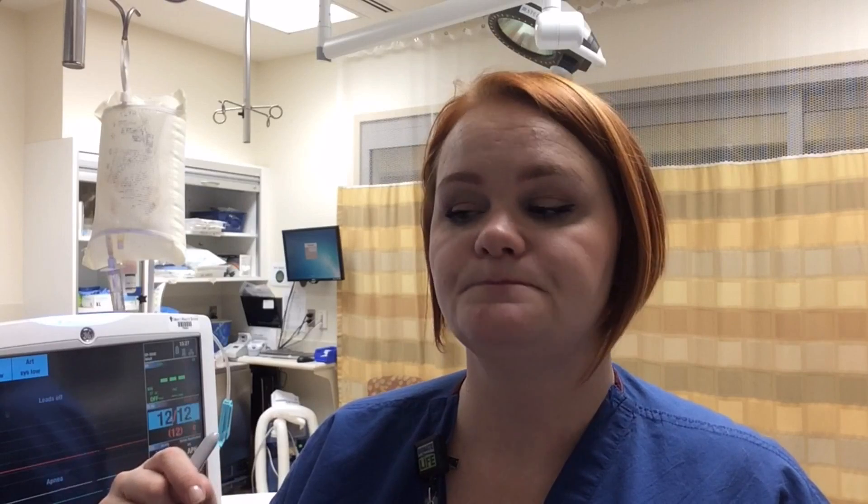Document that the arterial line was added, and make sure to document CMS — circulation, movement, and sensation — both before and after insertion. Check that the patient's fingers are pink, they have good sensation, and they're able to move their hands. If you have questions, feel free to ask the education team. There's additional information in LoSpeed consults, and practice tubing and equipment are kept in the educator cabinet in the old ambulance bay — feel free to go practice with it.